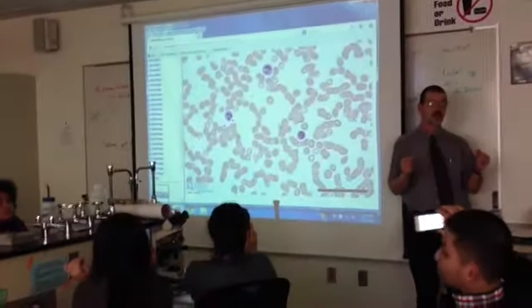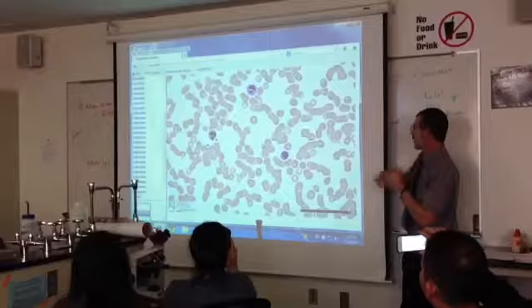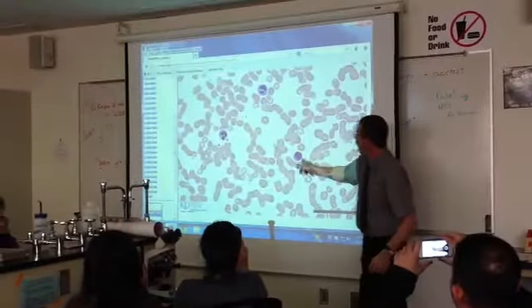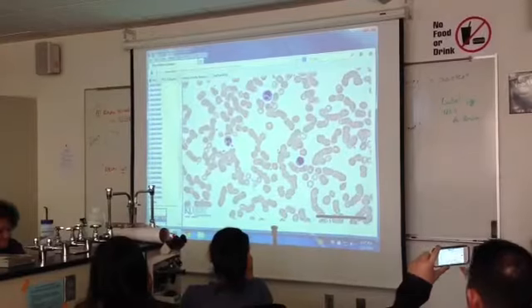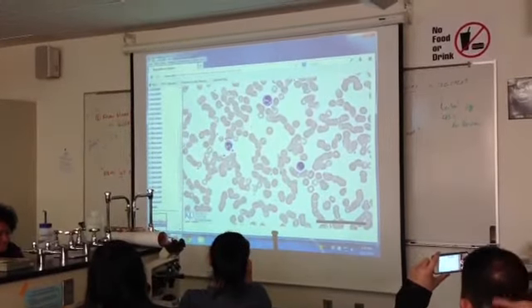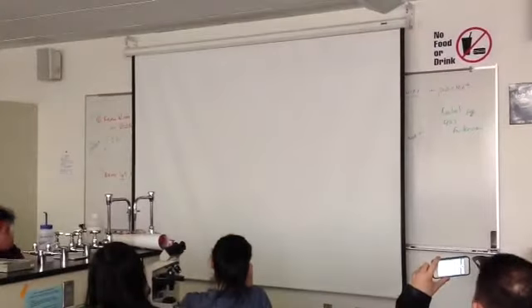Makes sense? So, reds, platelets, lymphocytes, neutrophils. Doing okay? So you're going to look at the nucleus, you're going to look at the speckling, kind of the overall shape. Problem is they vary a lot, so you have to sort of use all your instincts.